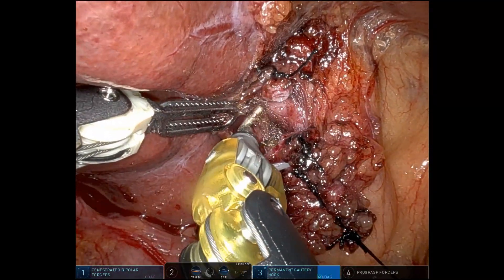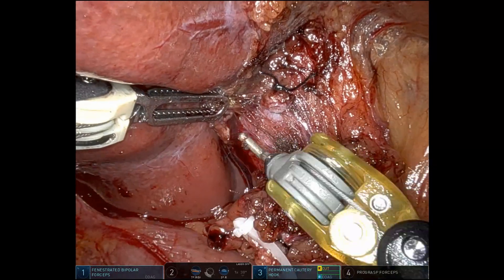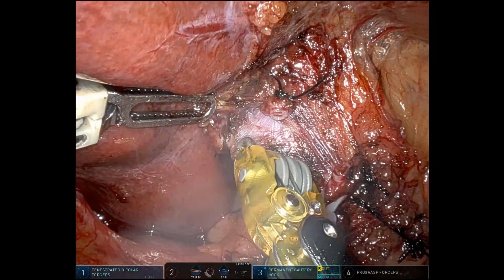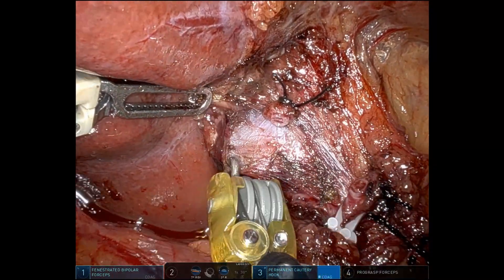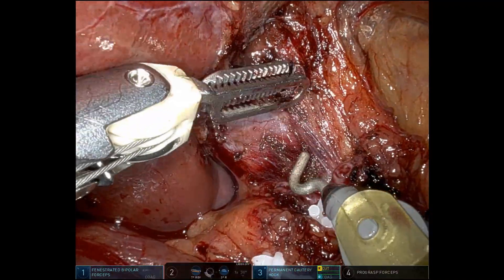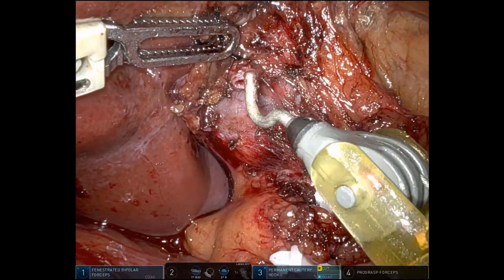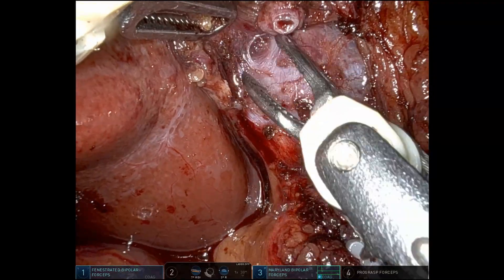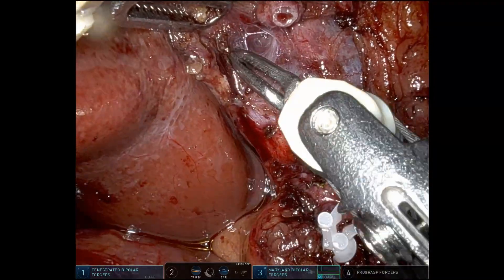Also this way, if we divided it with a weck clip, sometimes those weck clips can get in the way if you're going to use a stapler to divide a branch of the portal vein. Here as I said previously, it's a portal vein trifurcation, which you will see very clearly.